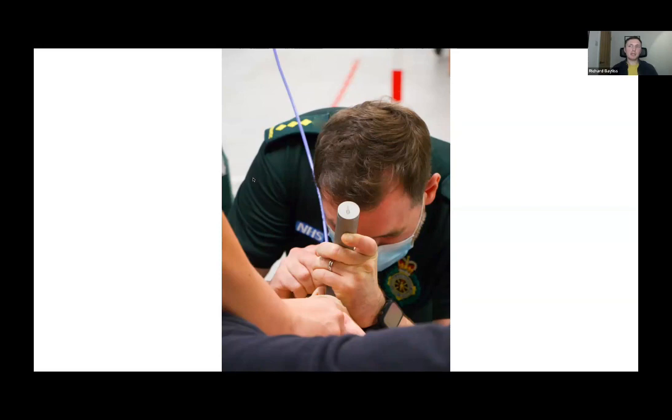They'll often be intubated on the floor, we've got limited access to the patient, limited ability to optimize the position of the patient, thinking about moving their head and their neck. From experience, they're also more likely to be overweight, and they'll almost always have airway soiling from gastric contents. So these are difficult airways in the pre-hospital environment.